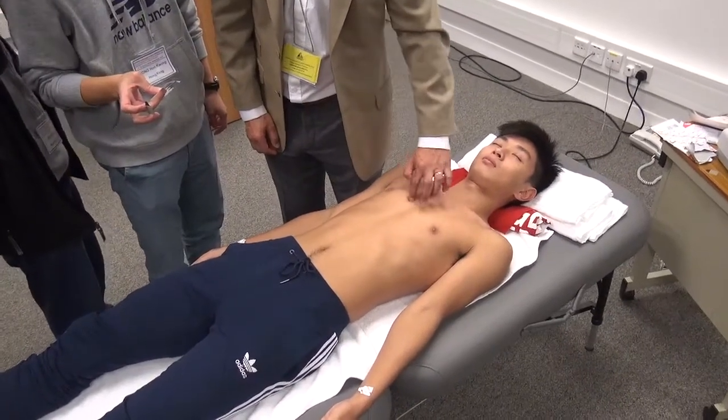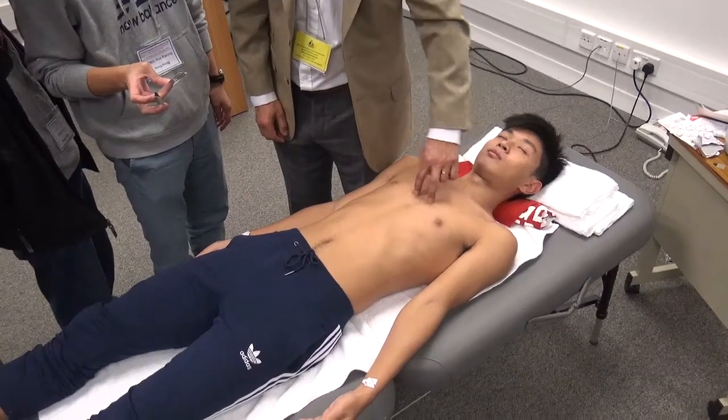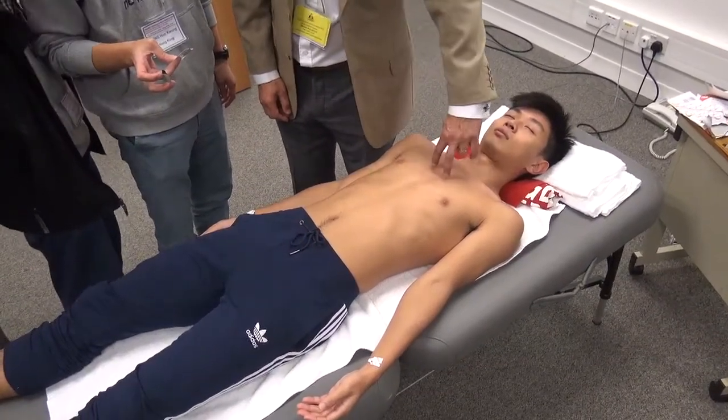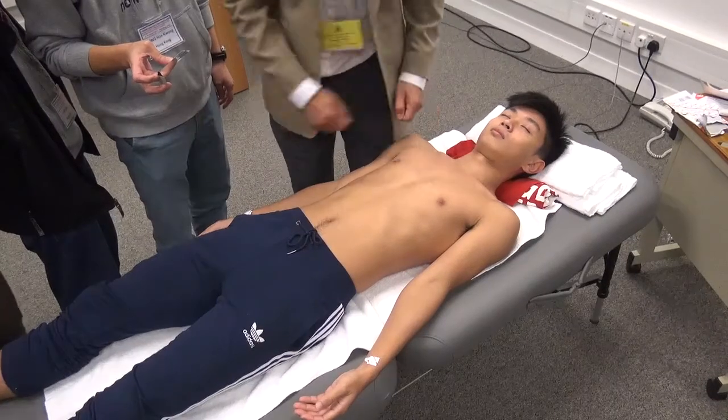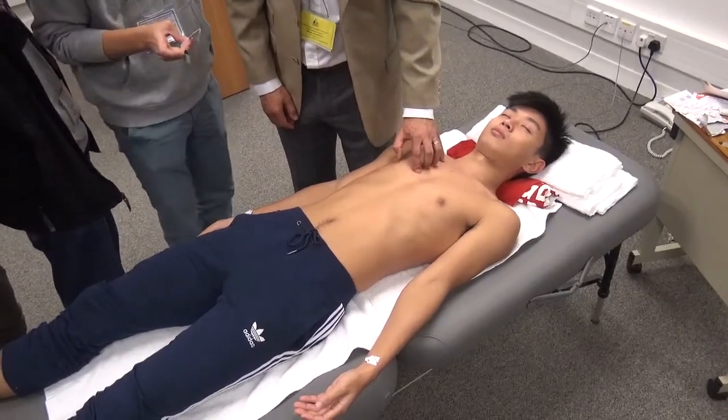You put that either side of the sternum here, and what you then find is actually, you're a lot lower than you think. When you look at people doing them, they often put them here in the second, because they just stick them on. But it's not. You've got to get it correct. 1, 2, 3, 4. Okay?